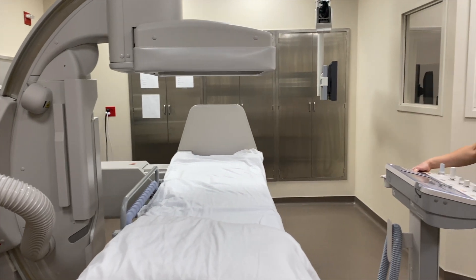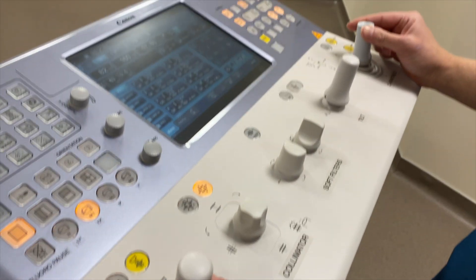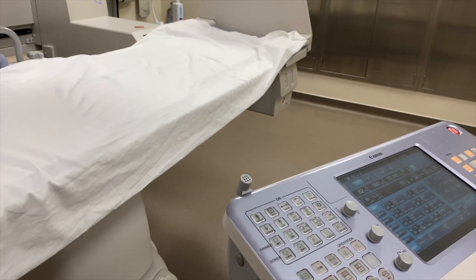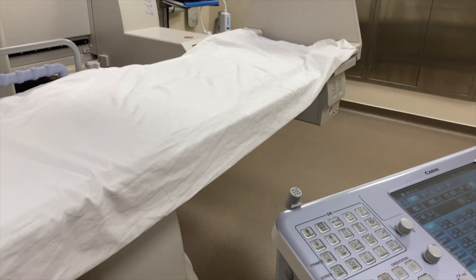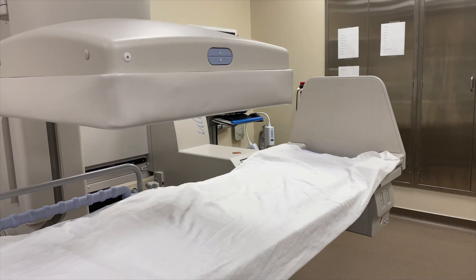This is our main control panel. This is how we can move the table, move the arm, rotate, move side to side on a patient, up and down. We can get the detector closer, which decreases dose for the patient.